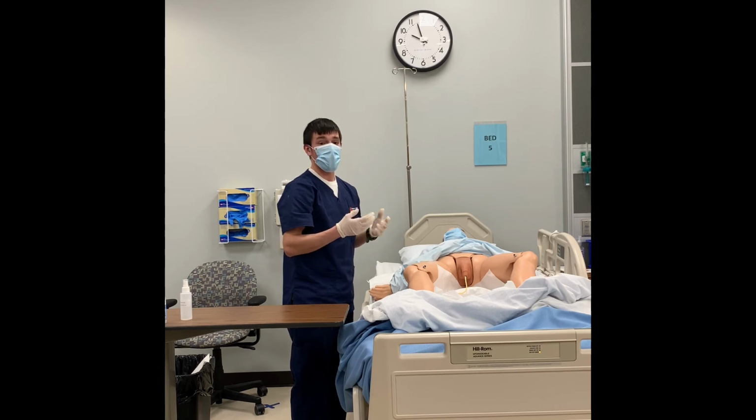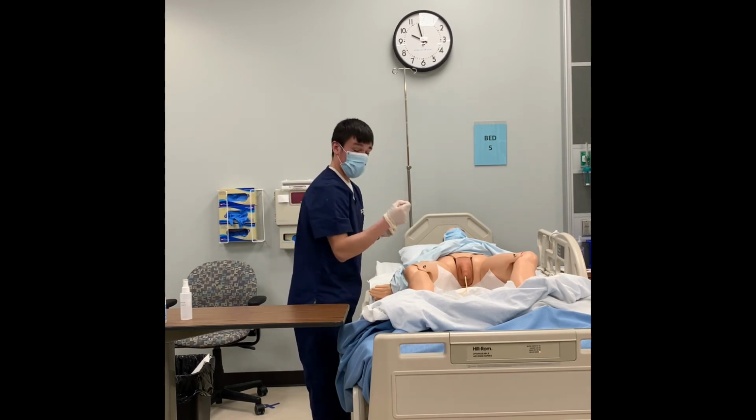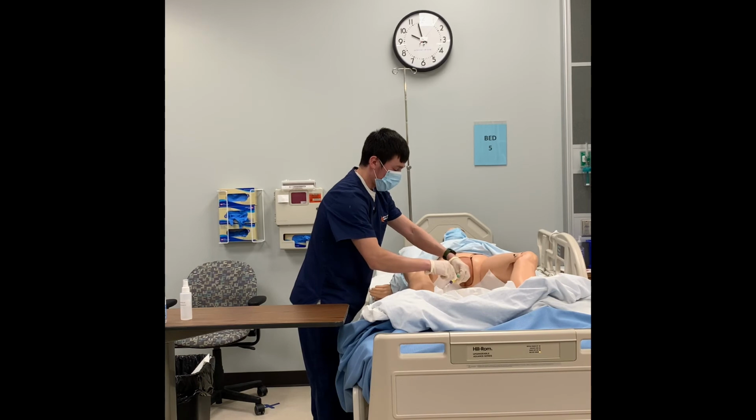So it's no longer a sterile procedure, it's just a clean procedure. So I just need my clean gloves. For this demonstration's sake, I'm going to leave my gloves on, but I would don my clean gloves after I perform my hand hygiene, and then I would have my syringe to remove the saline. So I'm going to insert it, and then remove the saline.